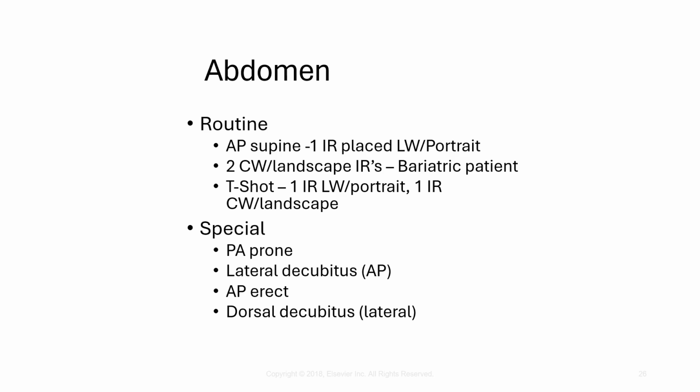With our geriatric patients, our elderly patients, one of the biggest concerns is probably comfort, and having extra patience to explain things to them and let them know what you need them to do and not do. With any patient, I would argue careful breathing instructions are essential so that you don't have motion on your radiograph.